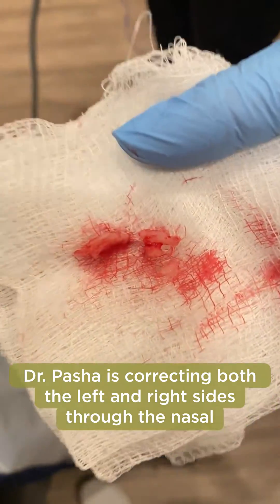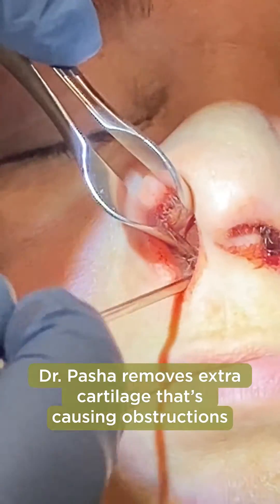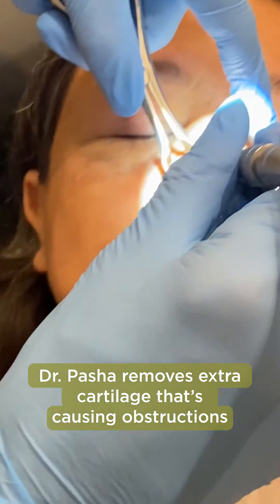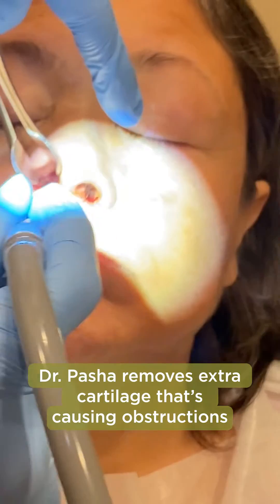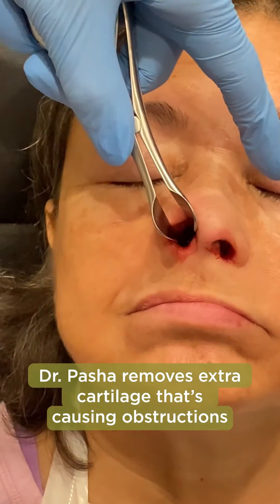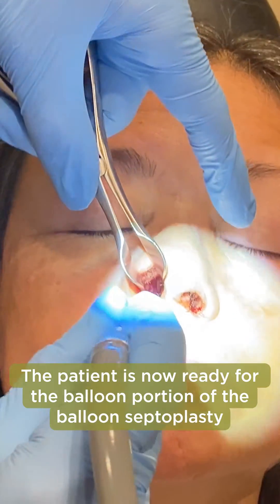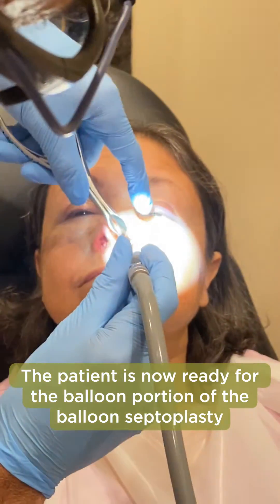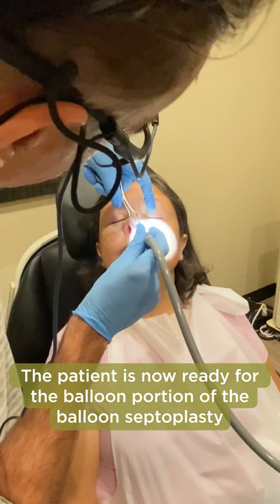It's working out nice. I'm going to free this cartilage — and it's already freed. There's a flap that I'm moving over now, and I got some residual cartilage. That looks good. This side looks fantastic. The septum is preserved, the mucosa — the septum is preserved, and I'm going to go ahead and move it over.